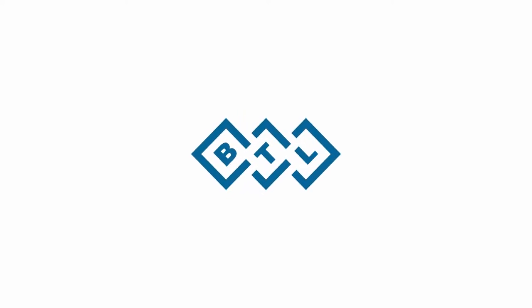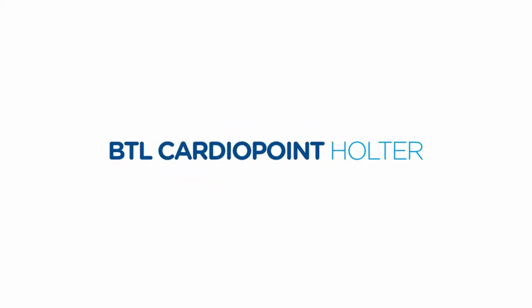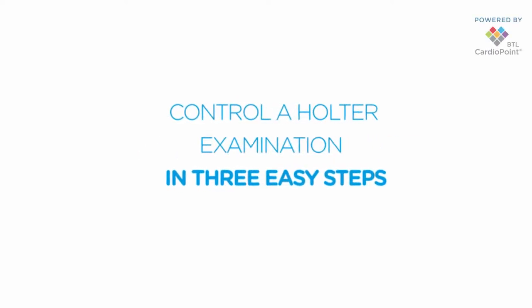Hello, today we are going to look at the basic principles of the Holter ECG analysis using the BTL Cardiopoint Holter Diagnostic System.